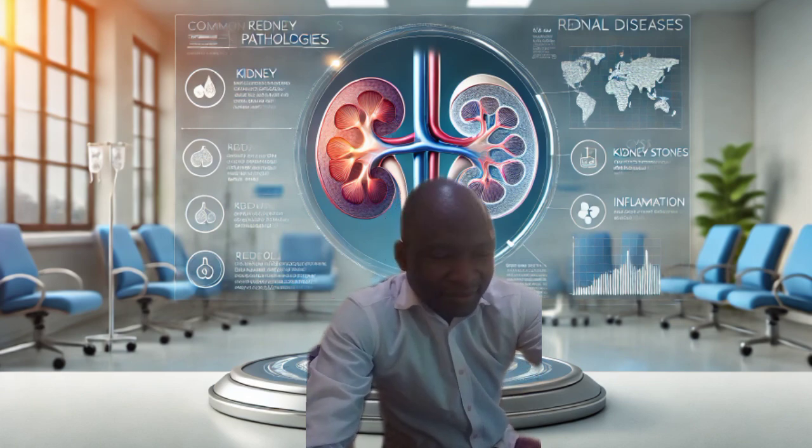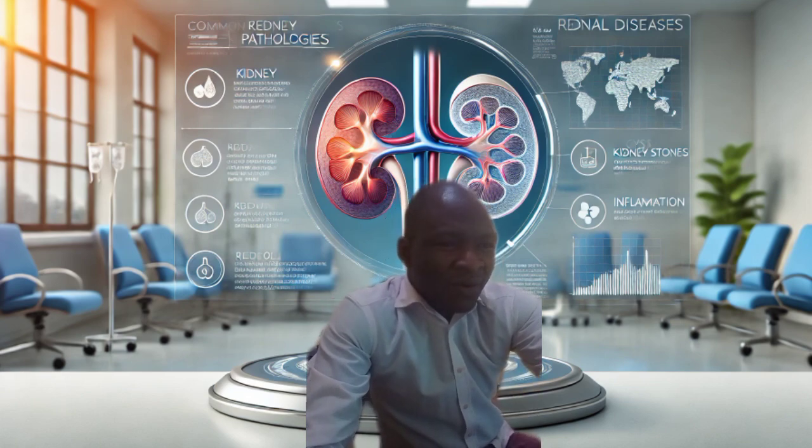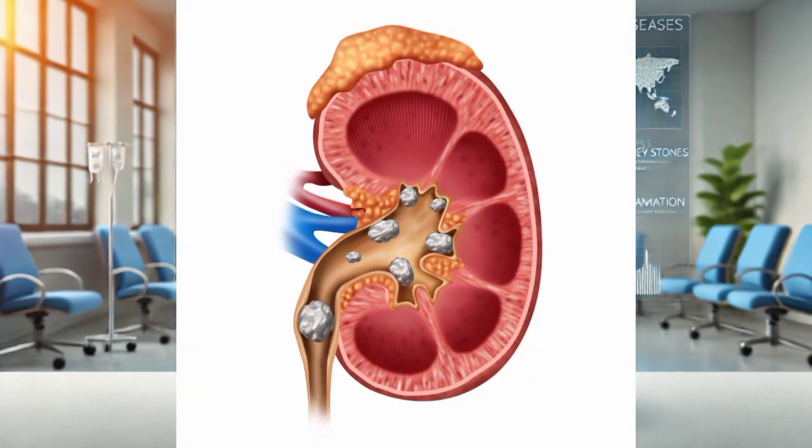Renal colic. Stone can occur in any part of the urinary system, but most commonly in the kidney, the renal cortex, medulla, vessels, calyces, or renal pelvis. These are the common areas. Most calculi arise in the collecting system.